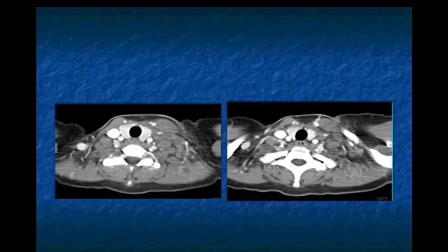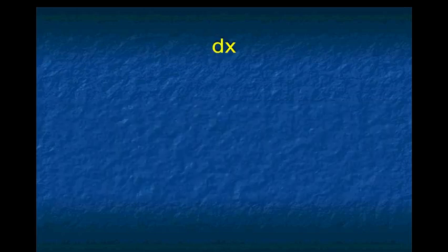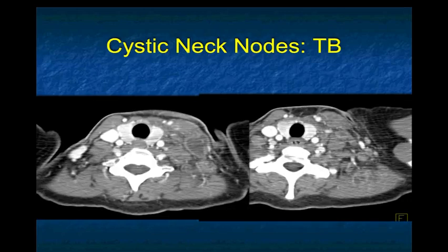So now malignancy obviously can include the vessels, but another process which gives you adenopathy occurs in the cervical region, can involve muscle, and can have vessel occlusion, is infectious, and the classic thing is cystic nodes from TB with muscle involvement and vessel occlusion. A really, really, really nice case.